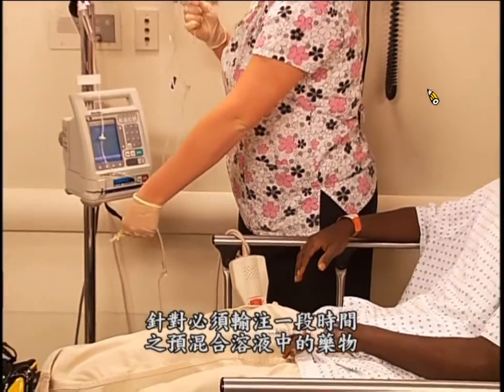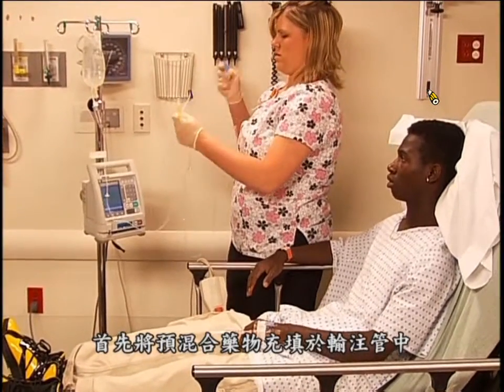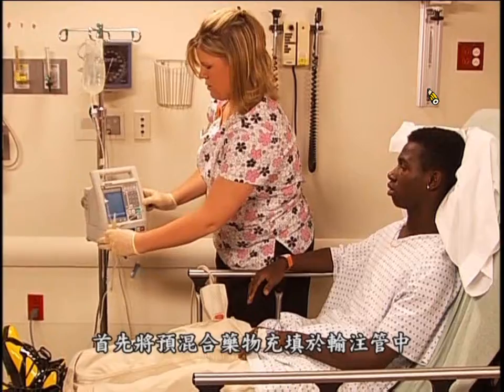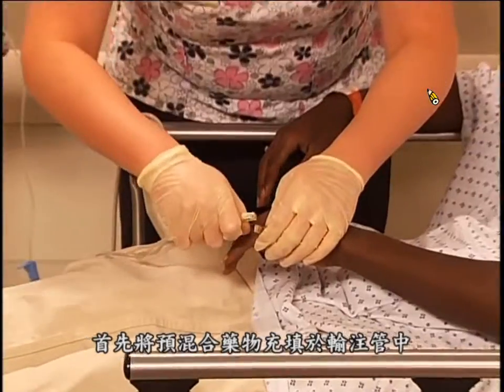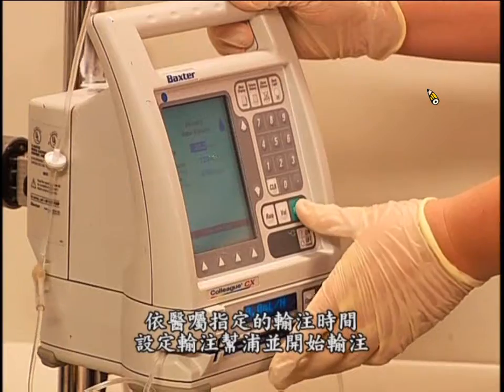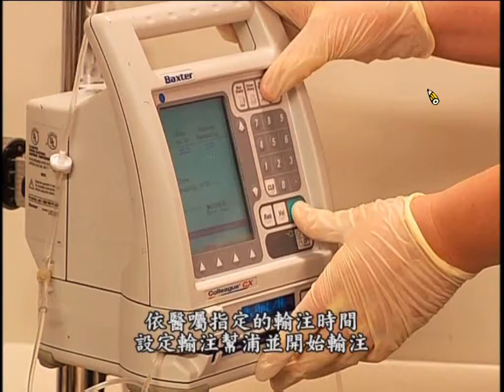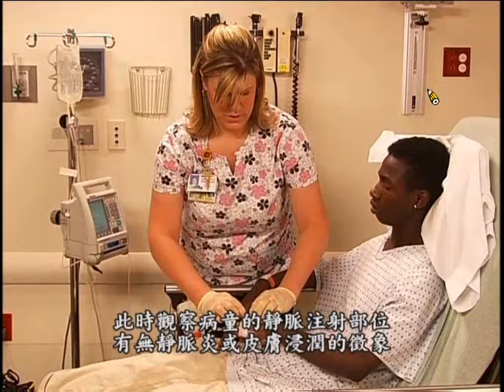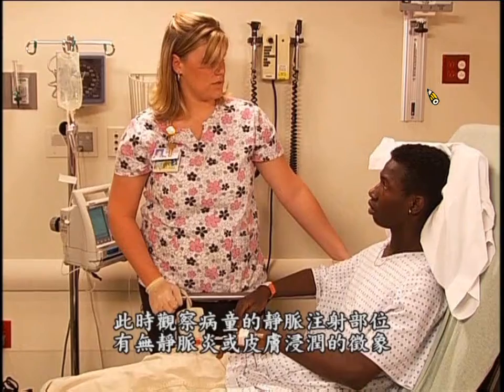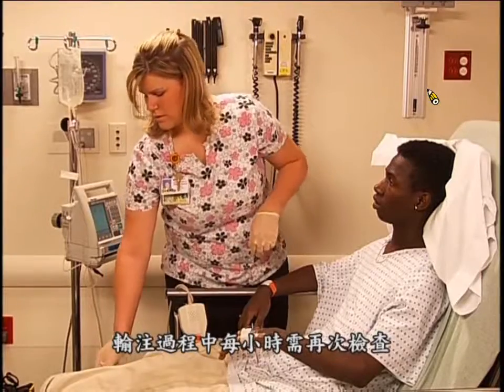For a medication in a premixed solution that must infuse over time, administer it by first priming the infusion tubing with the premixed medication. Then attach the infusion tubing to the port of the intermittent infusion device. Set the infusion pump to the prescribed infusion time and begin the infusion. Immediately observe the child's IV site for phlebitis or infiltration and recheck it once every hour during the infusion.